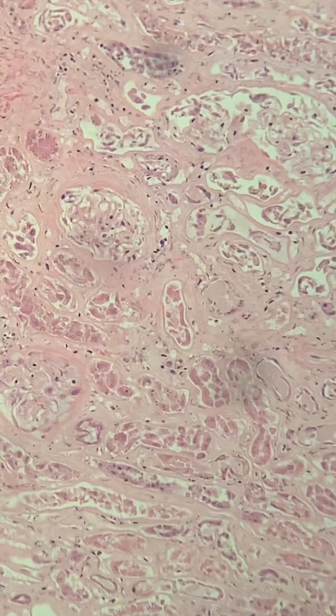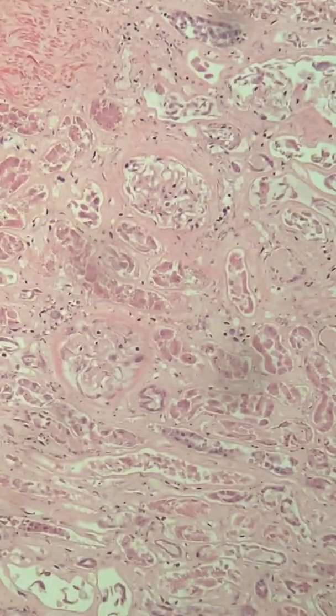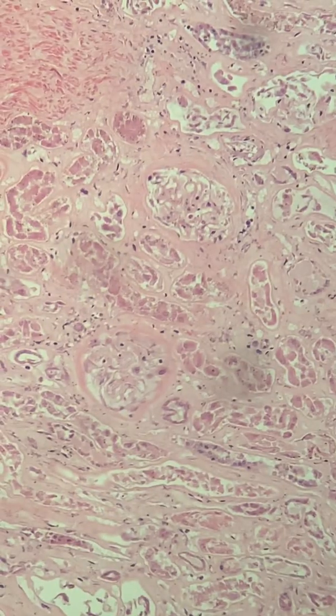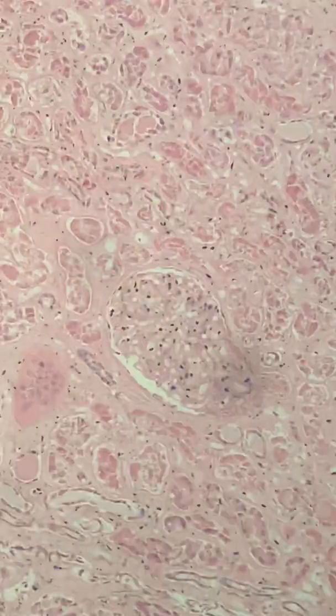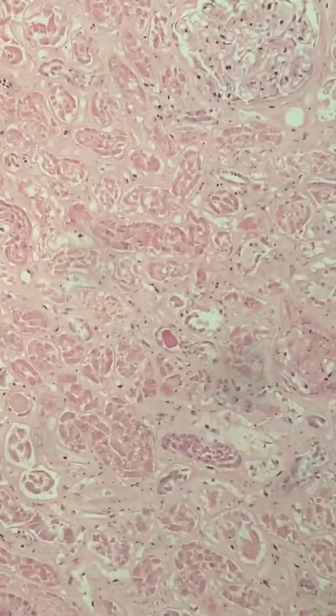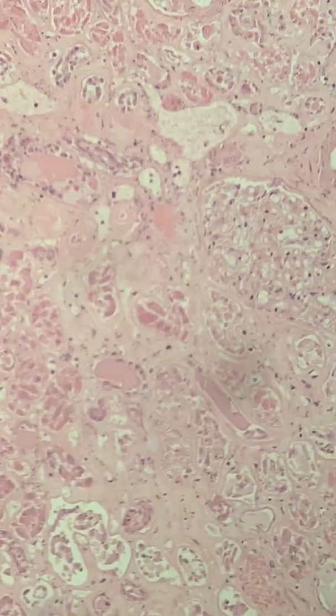And then we're getting into a glomerulus that had a little more damage, perhaps from hypertension, but still not bad. Still not bad. I mean, most people would love to have a kidney like so. Again, obviously affected by lack of perfusion towards the end of life. Very nice looking, normal looking kidneys.